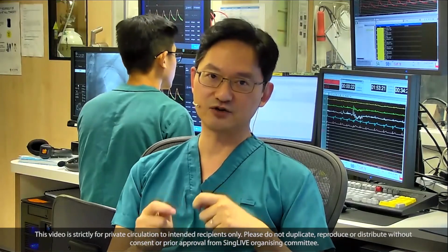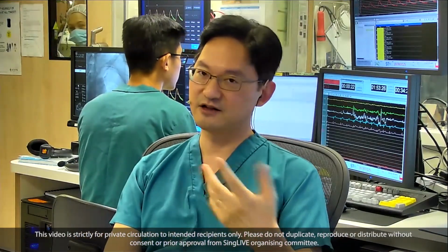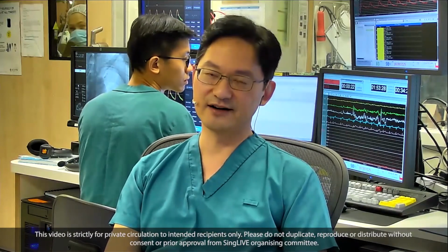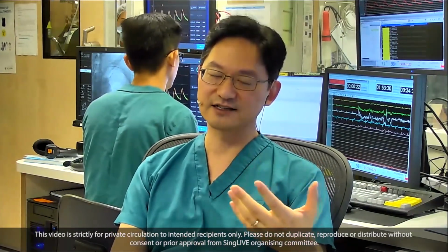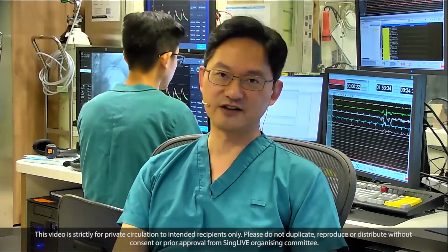So I can actually do all this. And if I'm going to be forward-looking, then in theory, you can also do interventional cases on patients with acute stroke. We all know that there's not enough interventionists to cover that kind of demand. So those are things that potentially can happen.